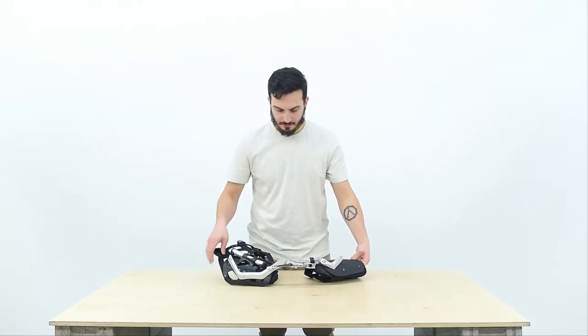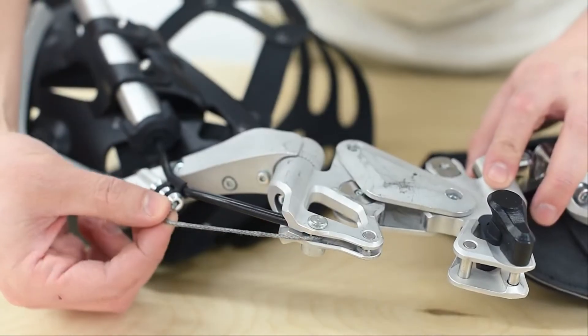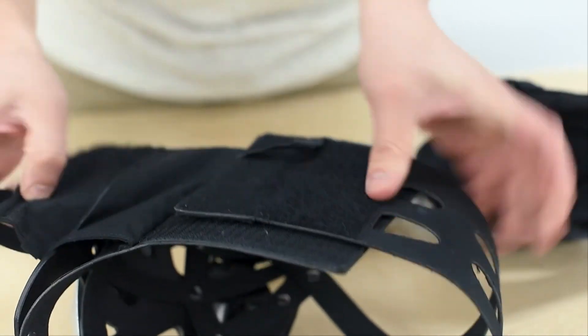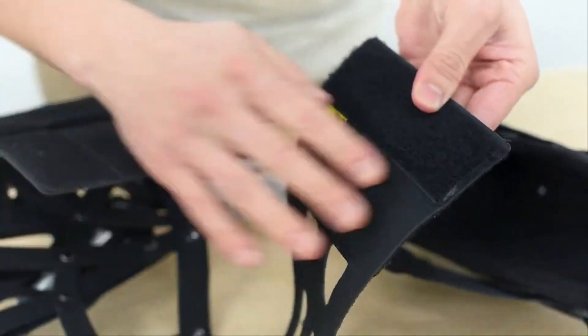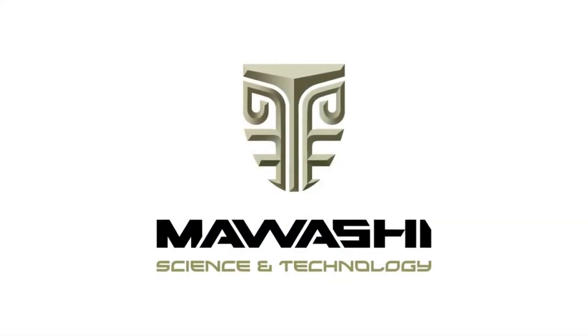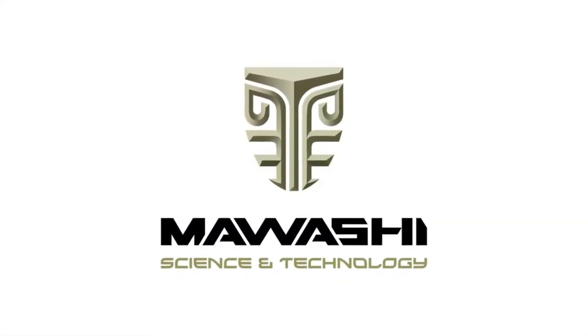For safety reasons, it is important to conduct regular visual inspection of the module. Periodically examine the condition of cables, plastic, and fabric components. If you notice anything unusual or require additional information, consult the user's manual or get directly in touch with us.